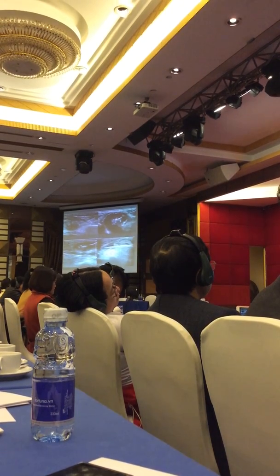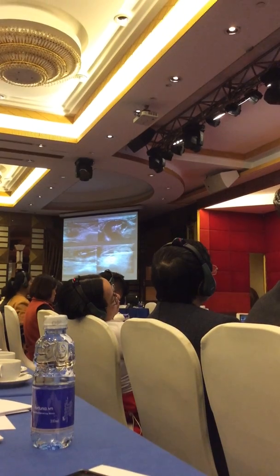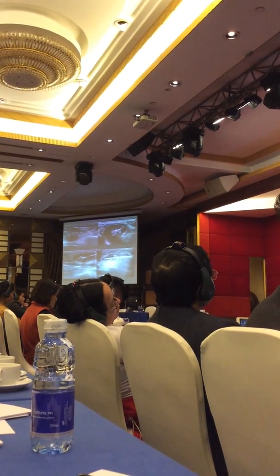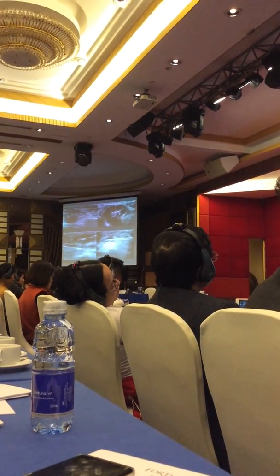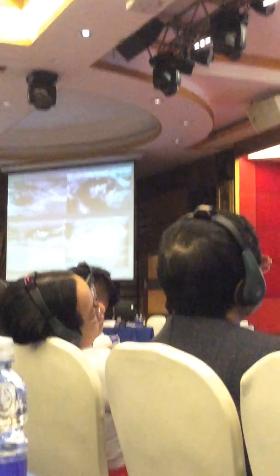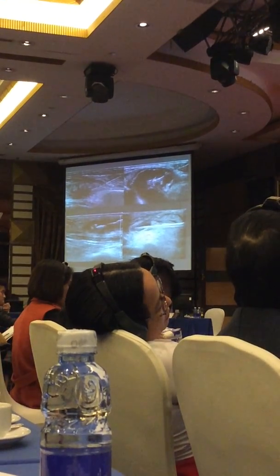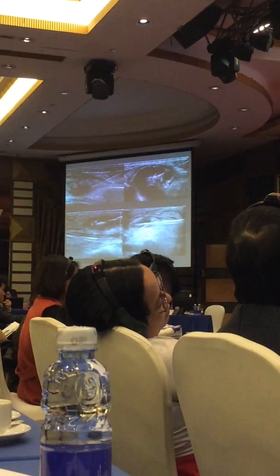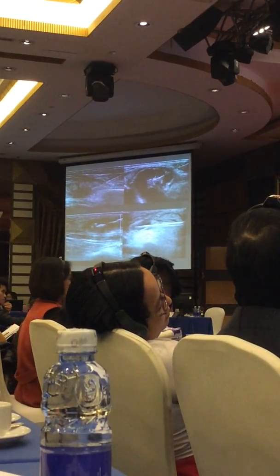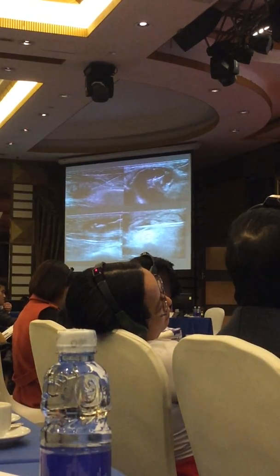So this is how an ultrasound-guided biopsy would look like on ultrasound. So you shoot the core first and then cut into the specimen by shooting the sheath. But if you have something very superficial or small, you may want to just put in the needle with the core already shot forward and then cut with the sheath.